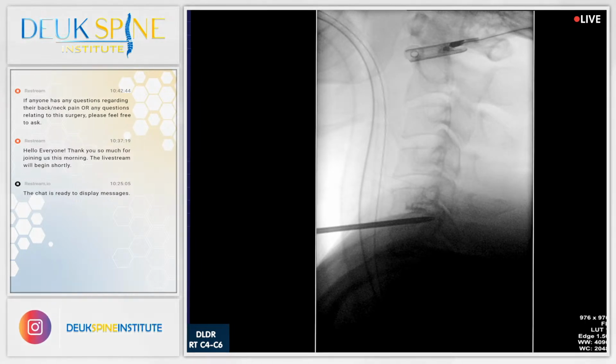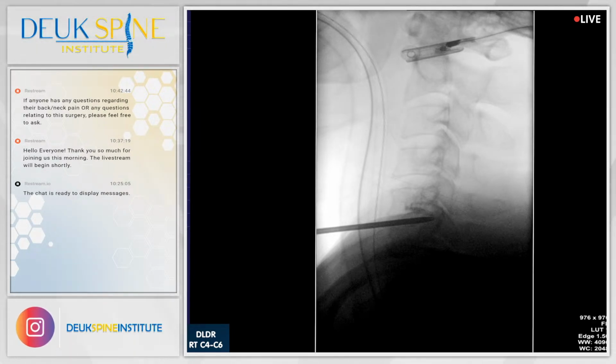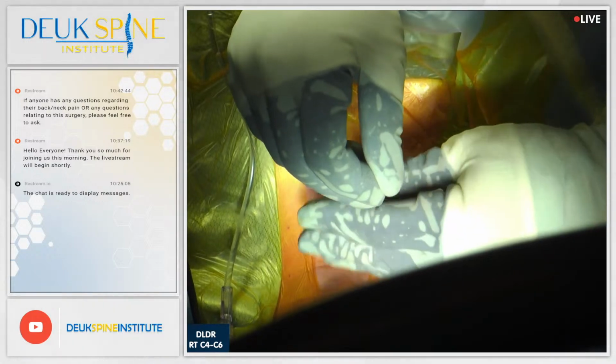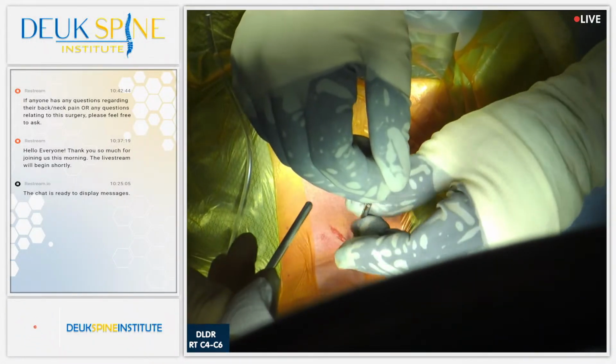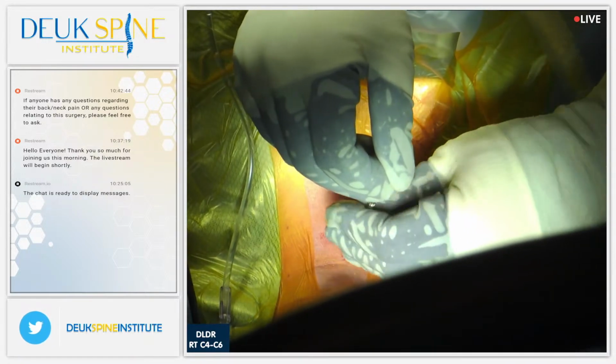All right, we're going to advance this dilator tip all the way to the back, and then I'm going to slide over the dilator this tube. This tube is what I do the entire surgery through. It's 4 millimeters, which is why the incision is only 4 millimeters. There's no damage done under the skin. We're not hurting anything in his body.